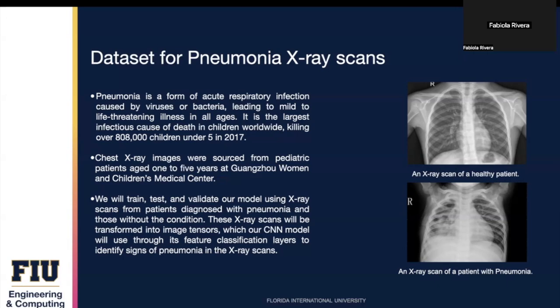As for our project, we're going to train, test, and validate our model with X-ray scans from both pneumonia patients and healthy individuals. We'll convert these X-ray scans into image tensors, and our CNN model will use its feature classification layers to detect signs of pneumonia in the X-rays.